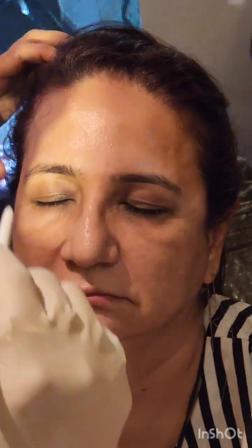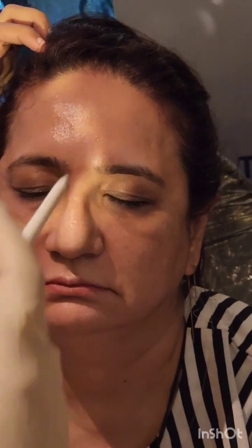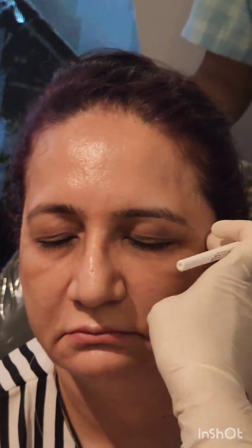That can be slightly up and down, it doesn't matter, because the ligament is covering the entire area. So anywhere you go, you will have a good anchoring. And on both sides it has to be the same. This is the zygomatic retaining ligament, right? So this is just over the zygoma. Palpate the zygoma, and just over that is the entry point.